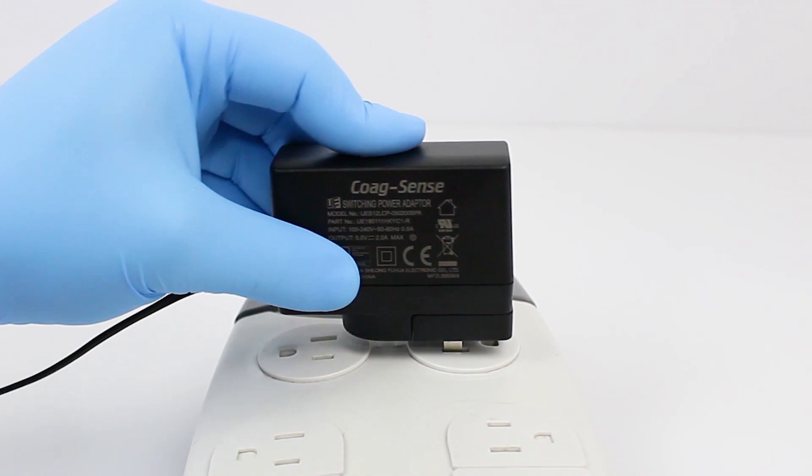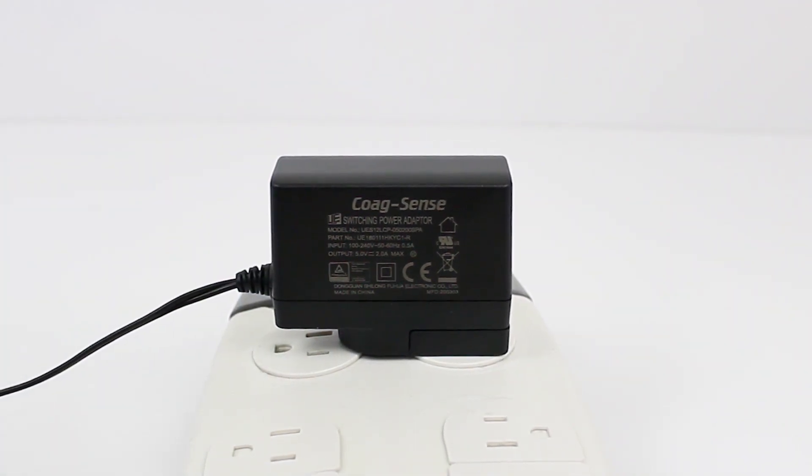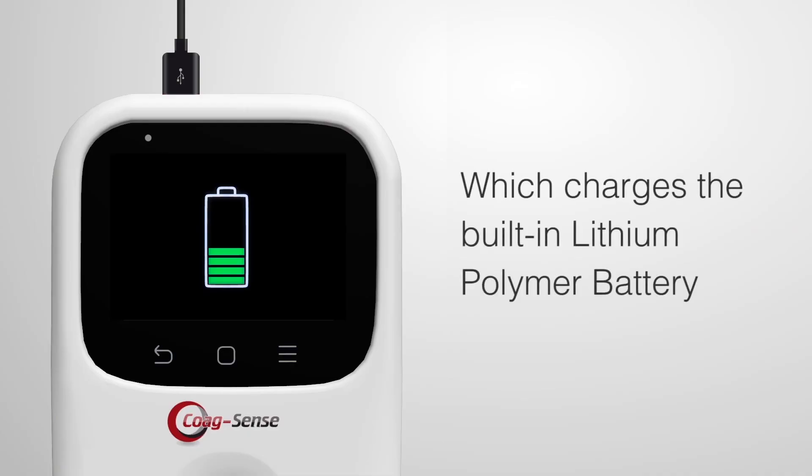The meter can be operated with a power adapter provided in the kit, which charges the built-in rechargeable lithium polymer battery.